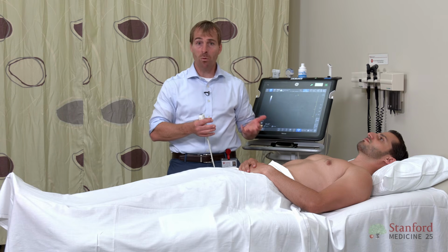So this is where you, as a POCUS practitioner, someone who does point-of-care ultrasound, you need to take the whole patient into consideration, okay? What was that sniff like? What is their underlying lung pathology like? You need to bring that into your interpretation as you're trying to understand what their central venous pressure is.